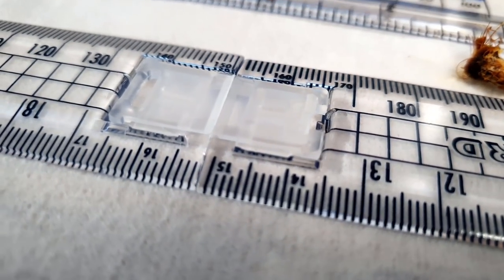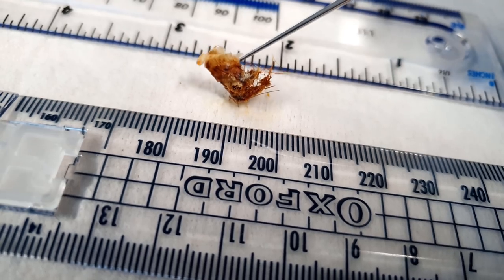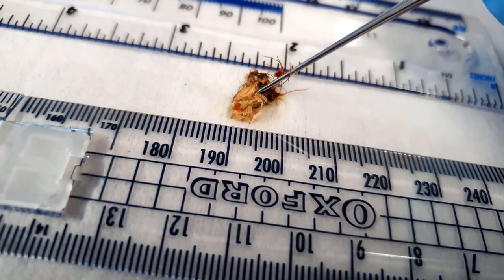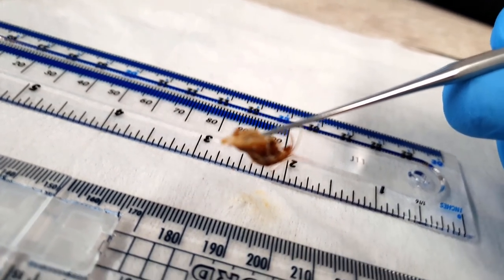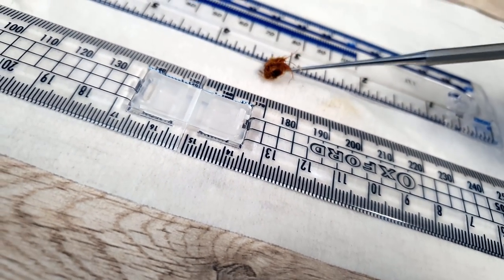And there's the plug — a good centimeter, I would say. I'm just going to turn it around so you can have a look at it. You can see the hair that's wrapped around the beginning near the canal — I'm fairly sure that hair has come from the patient shaving hair from the external ear, the little tragus area, which is this triangular portion on the outside of the ear. A lot of elderly gentlemen like to shave that area, which obviously did not help with the tissue paper. So hair, tissue paper, and earwax combined form this ultra strong plug.